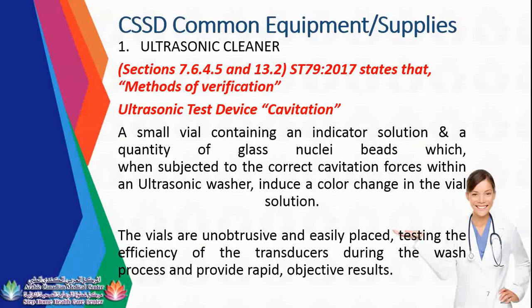As for the new updates, it contains a small vial containing an indicator solution and a quantity of glass nuclei beads, which, when subjected to the correct cavitation process within an ultrasonic washer, induce a color change in the vial solution. You just soak the vial in the ultrasonic machine and then wait 60 seconds and it will change. I'll send a video in the group so that you can see how it works.